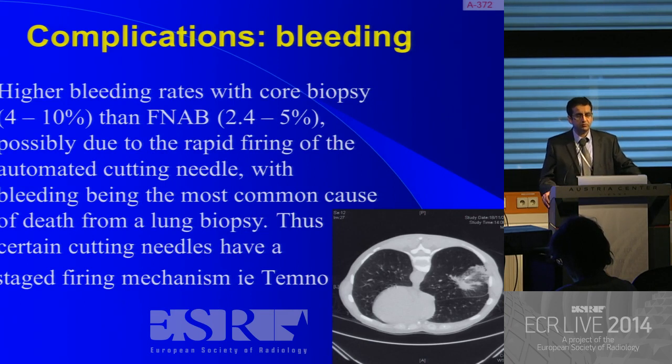Bleeding rates are also seen to be higher with fine needle with core biopsies rather than fine needle aspiration. And bleeding is the commonest cause of death from a lung biopsy.